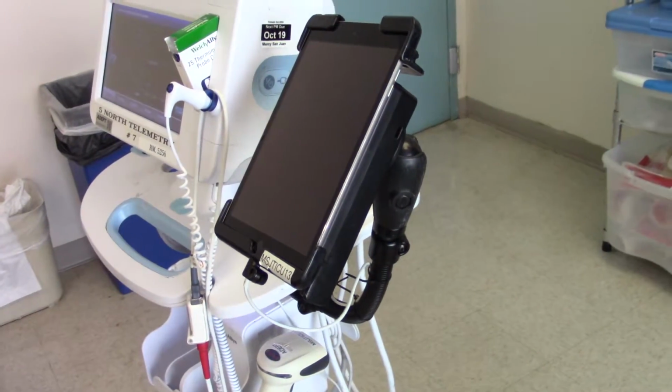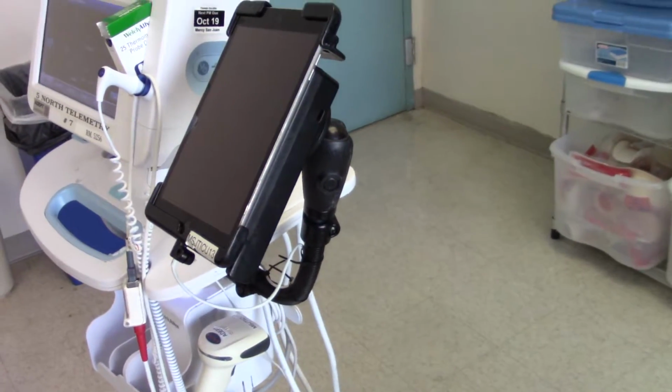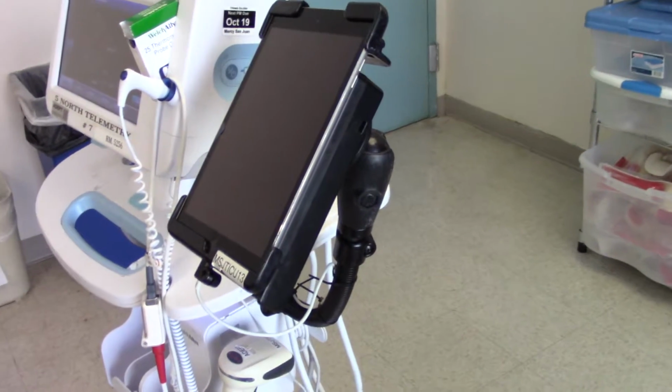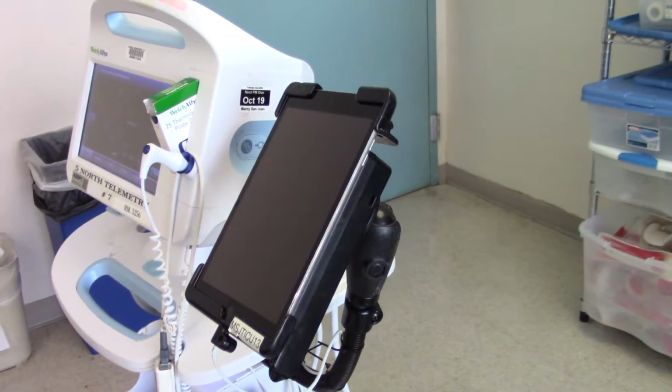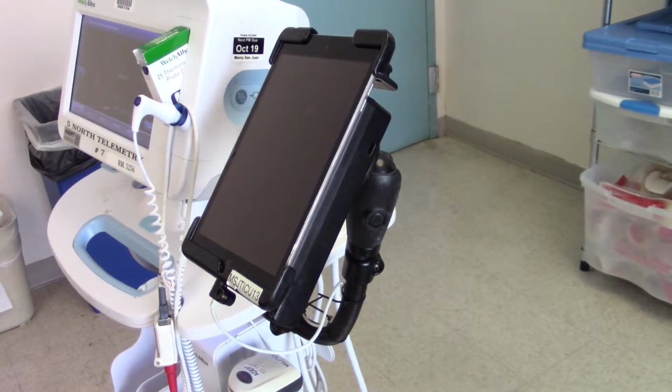And with regards to the arms, do you guys have any particular hospital standards that it's got to meet? No, not that I'm aware. Biomed would be the ones to inform on that. Okay, so we should ask them about that. You could ask them. I don't think they're going to care as far as that.